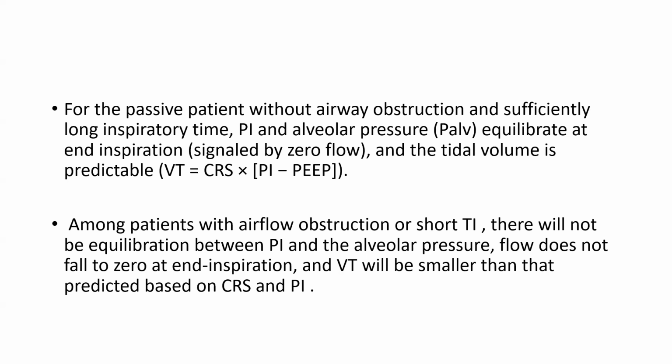For a passive patient without airway obstruction and with sufficiently long inspiratory time, inspiratory pressure and alveolar pressure equilibrate at end inspiration and tidal volume is predictable. The tidal volume is equal to respiratory compliance times inspiratory pressure minus PEEP. In patients with airflow obstruction or short inspiratory time, there will not be equilibration between the inspiratory pressure and the alveolar pressure, and the flow does not fall to zero at end inspiration.